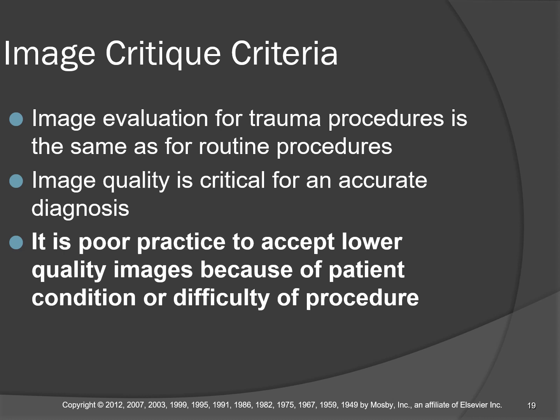Should the part be rotated? No. In fact, in a trauma case, your positioning and your image quality should actually be held to a higher standard. It is poor practice to accept lower quality images because of patient condition or difficulty of procedure.